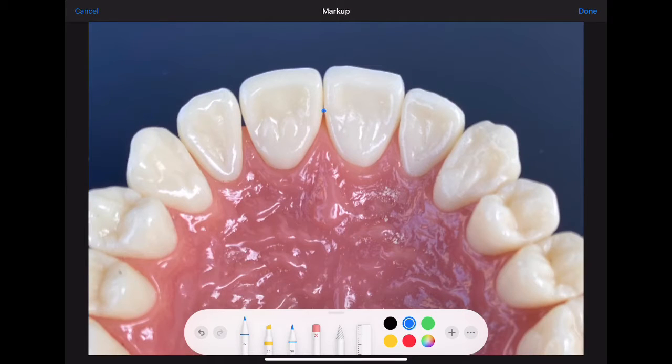Pre-clinic, before prepping, visualize your gingival and incisal contacts. Your class 3 preparation will keep incisal contact intact and just minimally break gingival contact. It's acceptable to have a 0.25 to 0.5 millimeter bevel. Your incisal contact is kept intact. Your gingival contact allows just the tip of the explorer to pass, and facial contact is minimally broken.